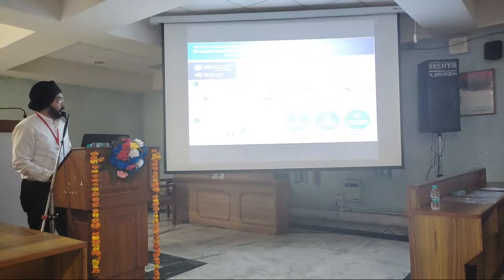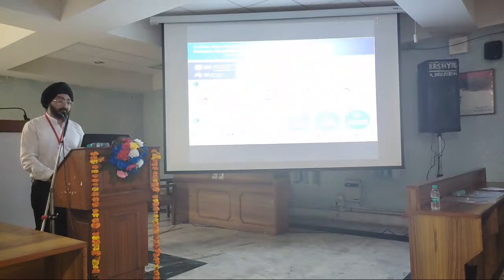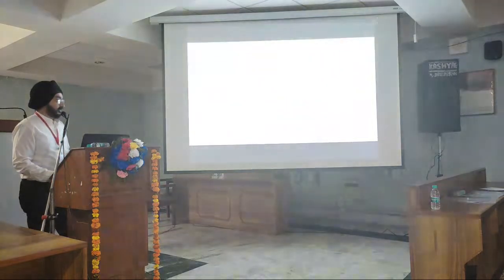Regarding staging, one of the big prospective trials was the proPSMA trial. They had around 302 patients, in which they showed that the overall accuracy of PSMA PET was 92% compared to 65% for CT plus bone scan for soft tissue and bone staging. And it overall had a greater impact on management as compared to conventional CT and bone scan imaging, and less equivocal results. So it established that PSMA PET-CT is a better modality for staging of intermediate to high risk prostate cancer patients.